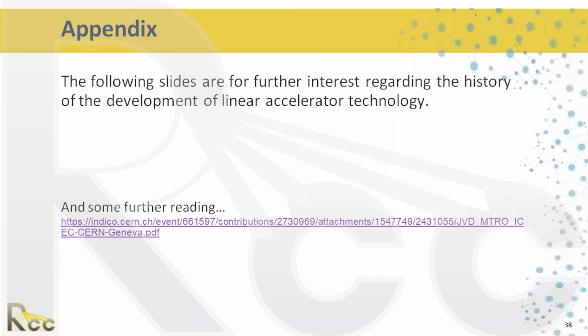All right. So from Malamadad: after photon interaction, secondary electrons are responsible for the energy distribution. Then how about electron energy treatments? So I didn't talk at all about electron energy treatments, but in a modern linear accelerator, they all have the ability to remove the target.